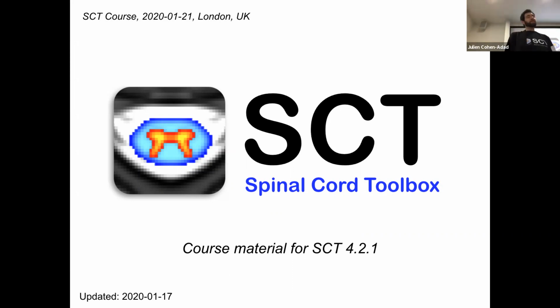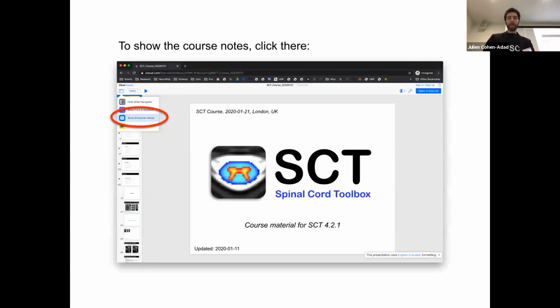Okay. Hello, everyone. Welcome to this new edition of the Spinal Cord Toolbox course, which is going to be compatible with version 4.2.1, which was released about a week or two ago. There are some changes compared to the previous courses. Before I start, I'm Julien Cohen-Adad, and we also have Olivier Vincent, who is right here and is going to help you all get the bugs fixed.